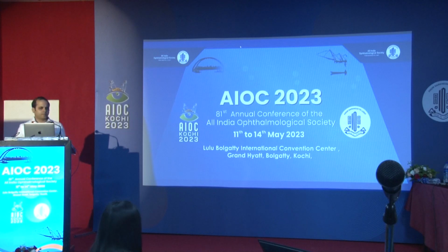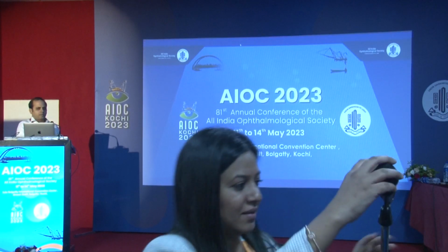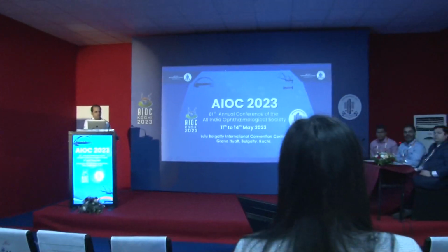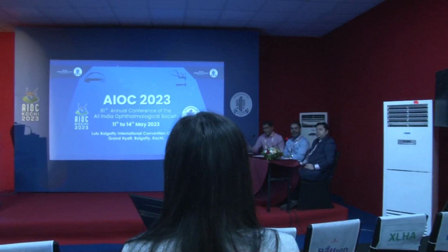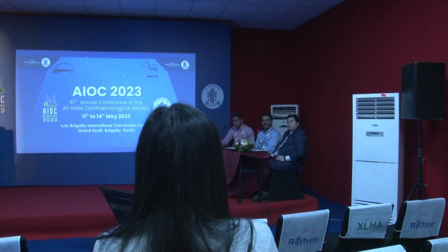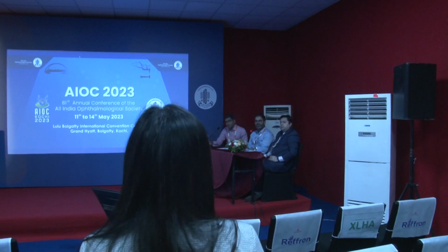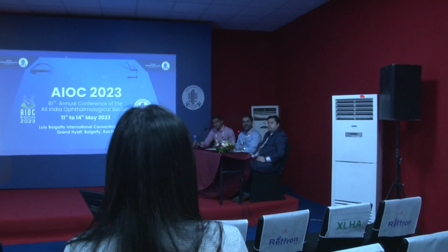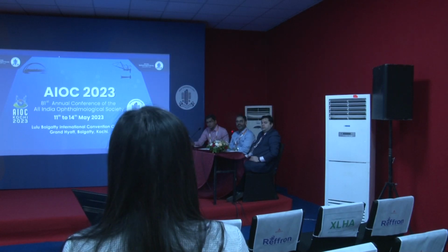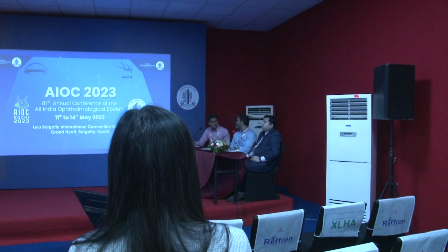Dr. Kumar, you want to add? I was just wondering about the macular hole that was present. As you said, ILM peeling would probably not have been the best idea. But what do you think is the mechanism here of the closure of the hole? Because the hole probably was created after the PVD, because we could not see it on the OCT. So what probably is the closure mechanism here? Did the gas help?